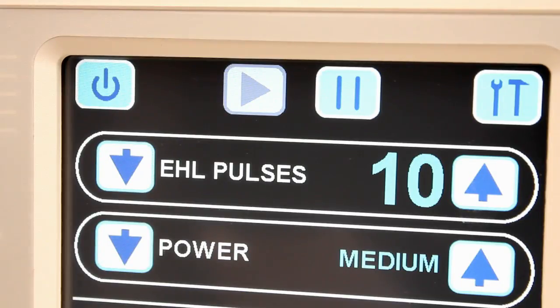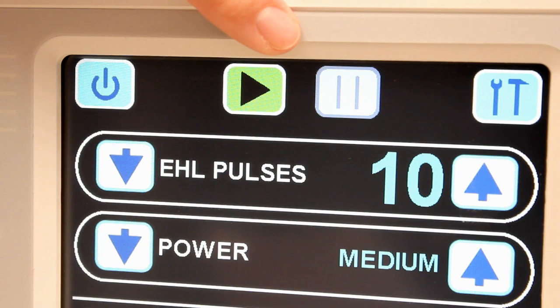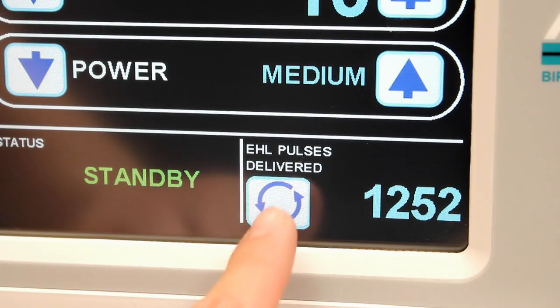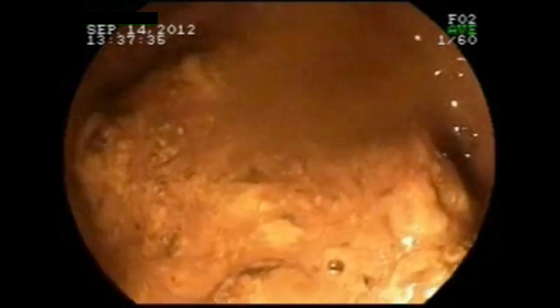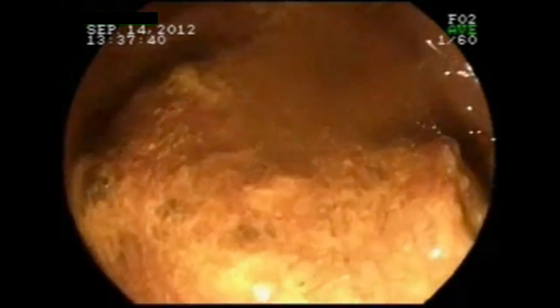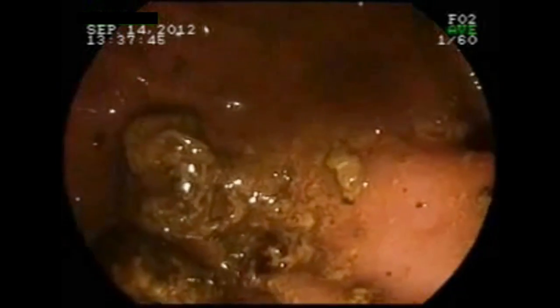During the procedure, depress the standby icon at any time when the EHL treatment is not required. This will prevent an unintentional discharge of EHL pulses if the foot pedal is accidentally depressed. The total number of EHL pulses delivered can be viewed during the procedure. Reset the value by depressing the reset value icon. When the lithotripsy procedure is complete, any remaining stone fragments may be removed from the ductal system using the methods and instrumentation recommended by the physician.